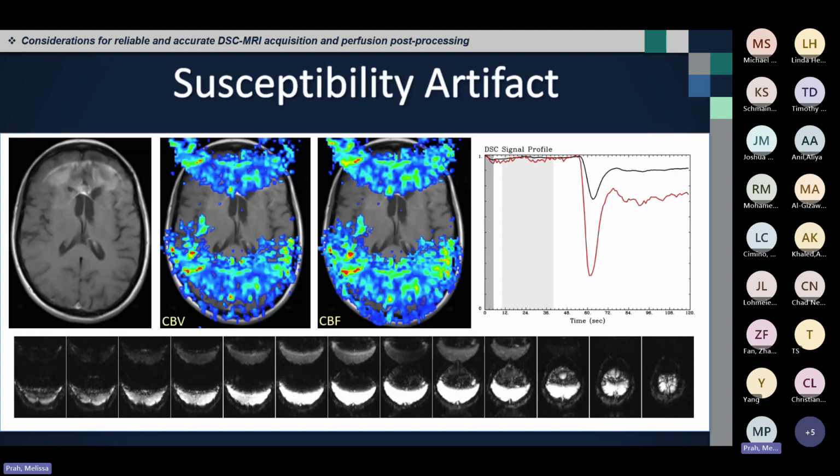The last couple examples will all showcase susceptibility artifacts. Since DSC exploits transient contrast agent-induced changes in susceptibility between the vessel and tissue, anything that affects susceptibility might also impact these measurements. Unwanted magnetic susceptibility effects might result in signal loss and distortion and can be observed in patients with, for example, implanted screws, surgical clips, blood products, and shunts, in addition to dental work and hair extensions.